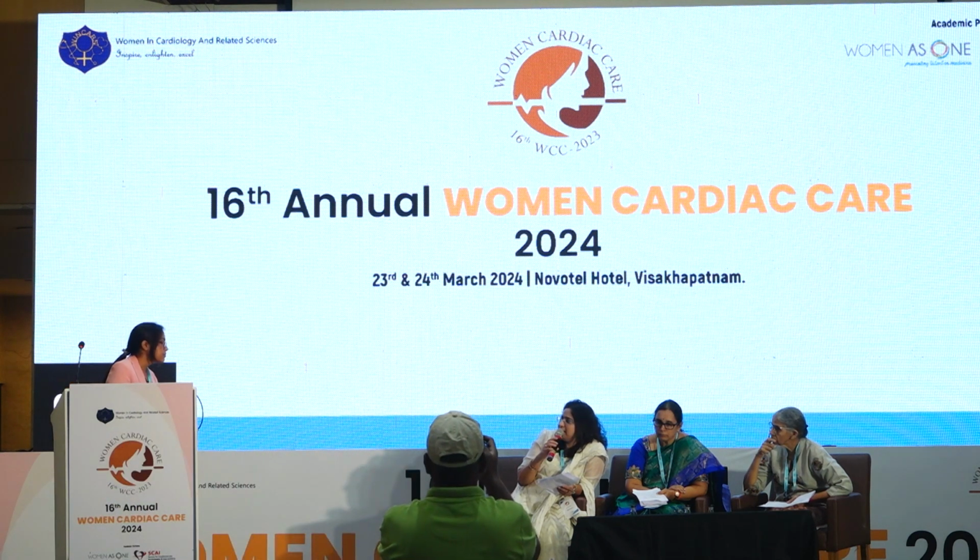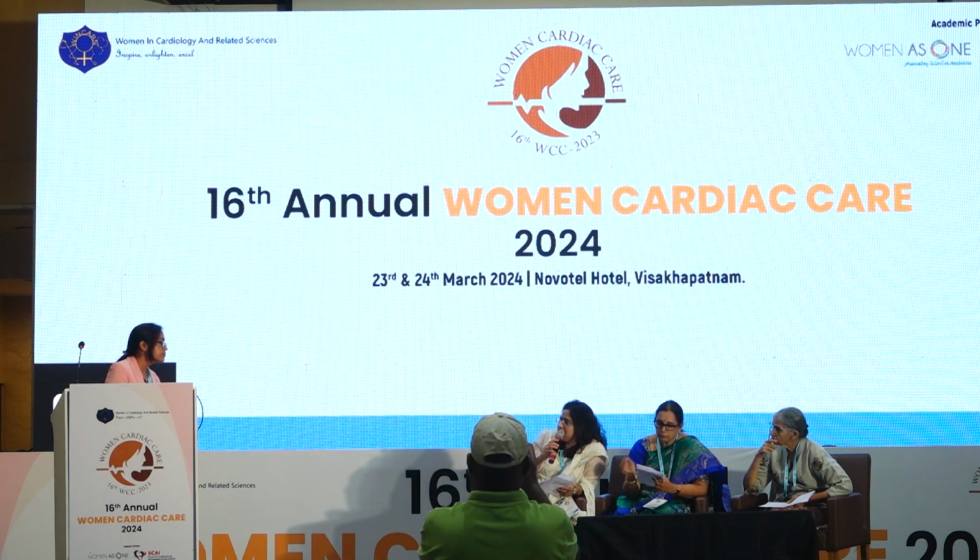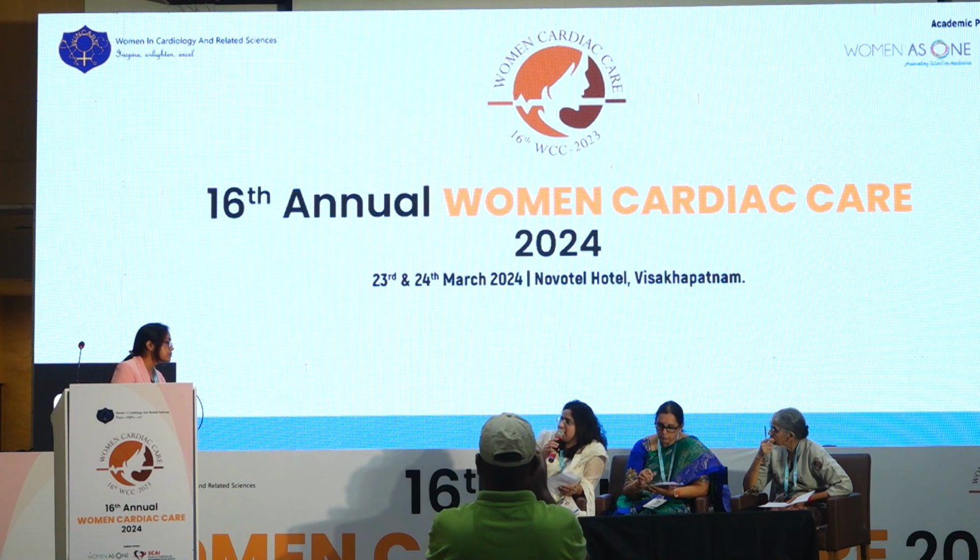It's really a very great case. You have really handled it well. Excellent case. In such situations, keeping your nerves down and handling the procedure is really important. I would like to ask, it is a complex procedure of LM, did you consider some kind of backup for the LAD, like a temporary pacemaker or IABP?